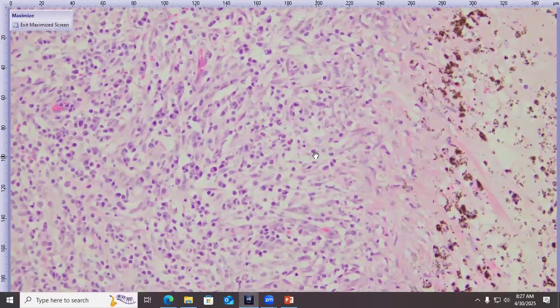The issue is that melanin can be released from a necrotic uvea regardless. So if the uvea is necrotic for any reason, you could get melanin here and there, and it could be phagocytized by macrophages. So just kind of a melanin-rich or melanophage-rich inflammatory infiltrate doesn't confirm uveodermatologic syndrome in an eye.